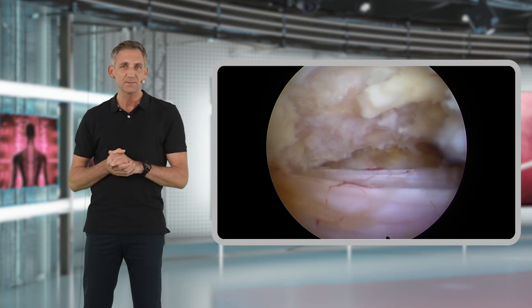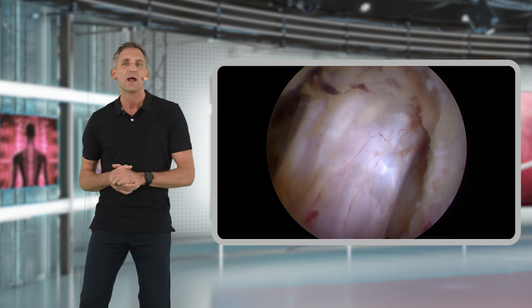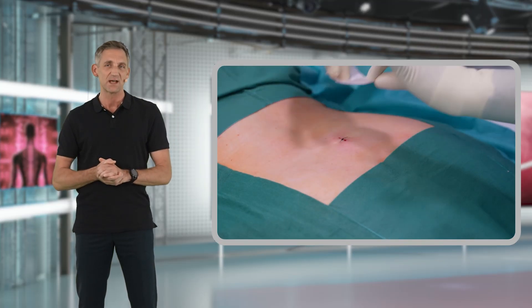Once you have taken all these steps, you will achieve a nice over-the-top decompression, and your final inspection will show that you have nicely decompressed centrally and the recesses on both sides.